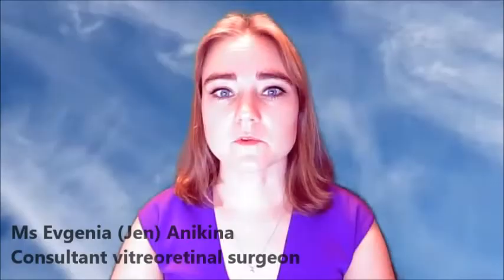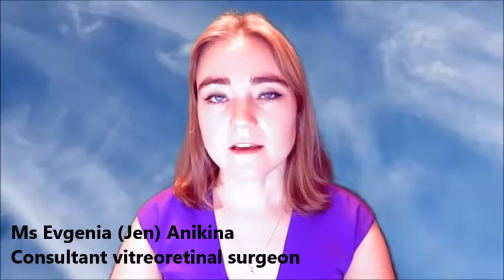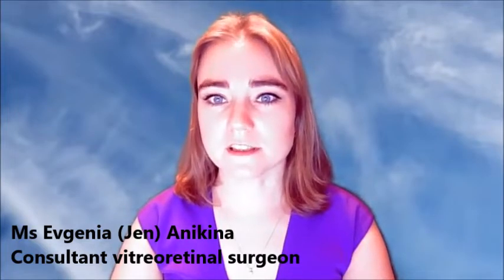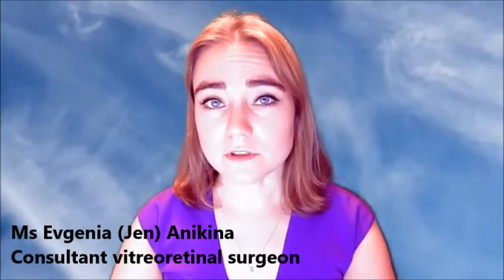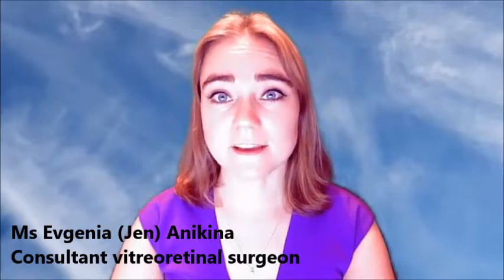This term can be somewhat confusing. It describes placing a lens implant in an eye when previous eye surgery has resulted in no natural or artificial lens being present in an eye, so-called aphakia. It also includes replacing a previously implanted intraocular lens that has failed in its function.